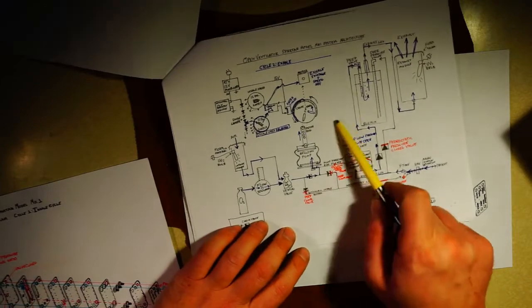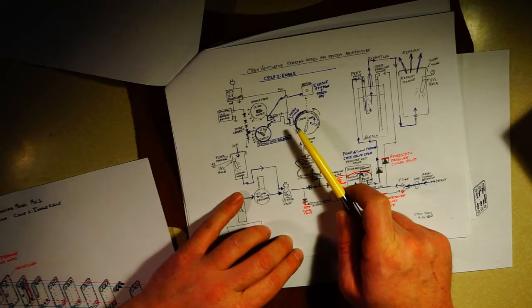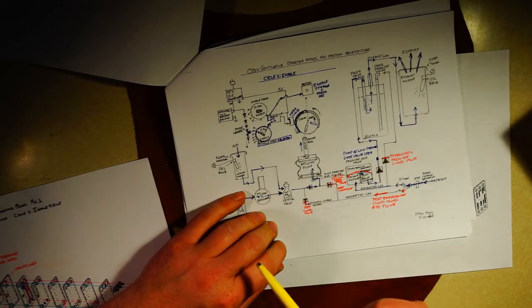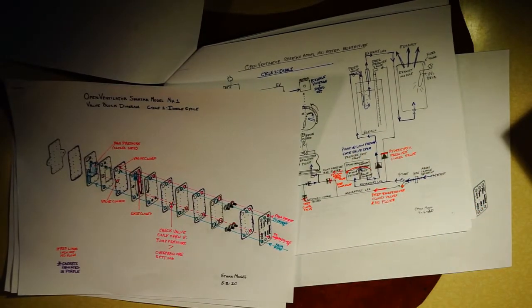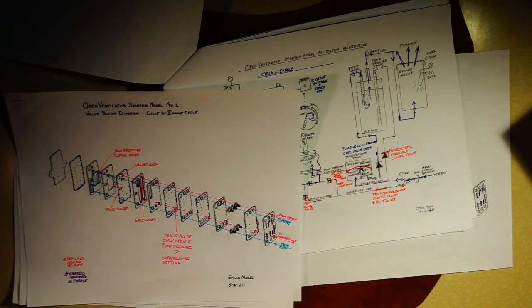As well, there are electrical flow diagrams corresponding to cycle 1, 2, and 2A in the documentation. So if you're really curious and want to match this guy to this guy, take a look at the OpenVentilator Spartan model Mark 1 version 5.2.20 in the GitHub, and that will have all of these images.